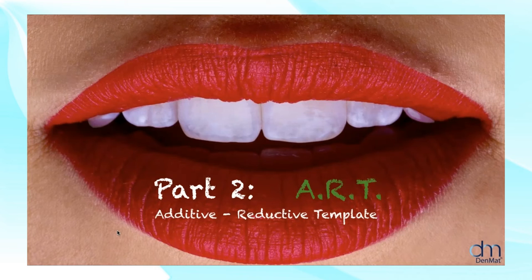A little background: the additive reductive template technique was made because patients want minimally invasive dentistry. That's what we have to offer. We have to offer responsible aesthetics. There's no point in having a great smile if you reduce the teeth all the way down to the dentin. So the ART technique allows you to create these great cases with minimal reduction.